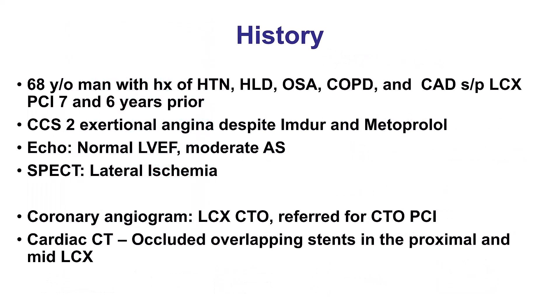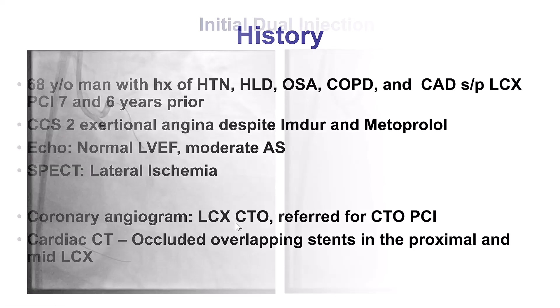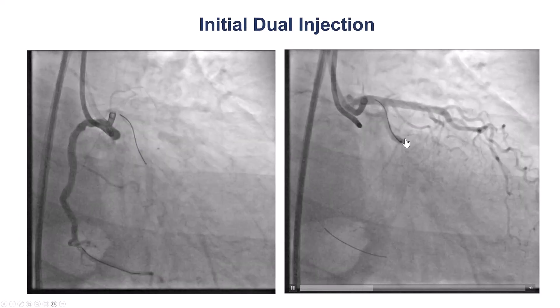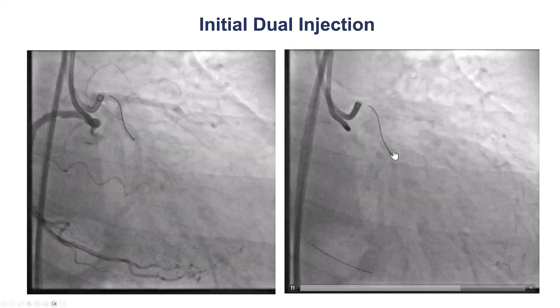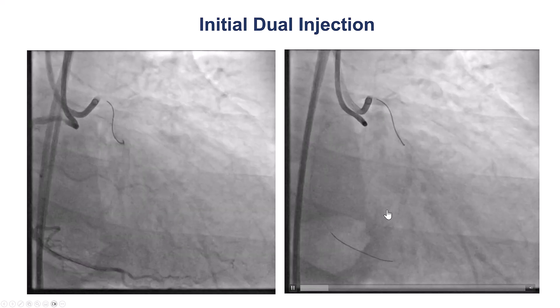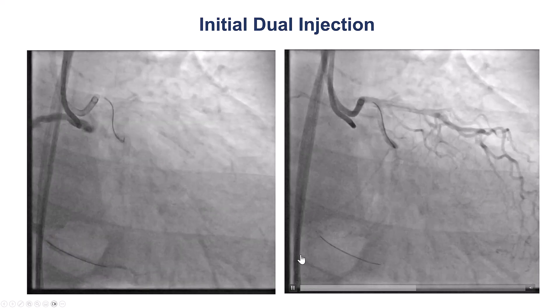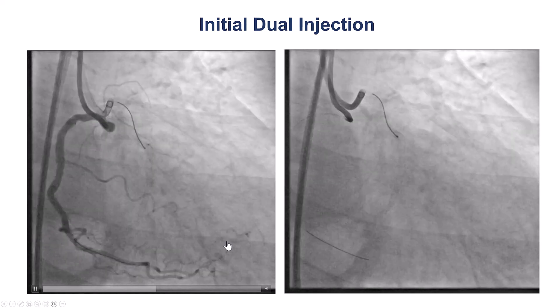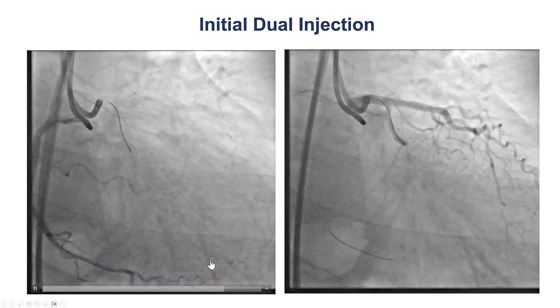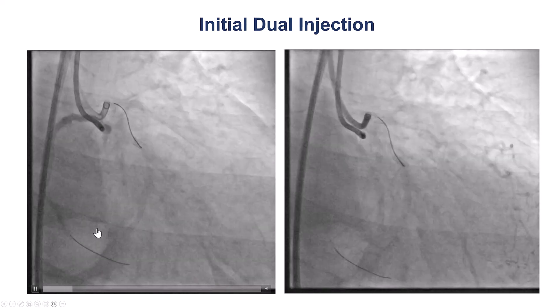The patient was a gentleman with multiple comorbidities and previously placed stents in the circumflex 7 and 6 years prior. He presented with angina, was found to have lateral ischemia, and was found to have occlusion of the circumflex stents. The coronary angiogram shows a blunt proximal cap with occlusion of the previously placed stents, and only faint filling of the obtuse marginal branches, mainly through contralateral collaterals.